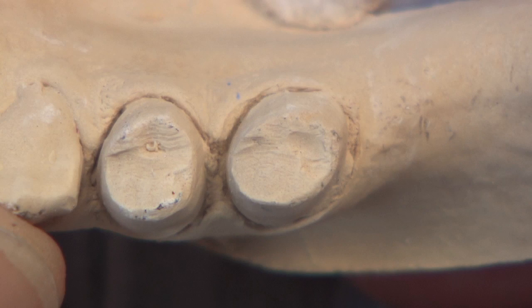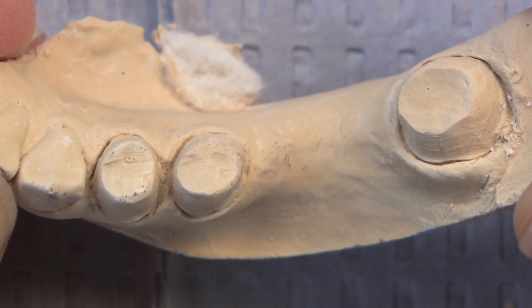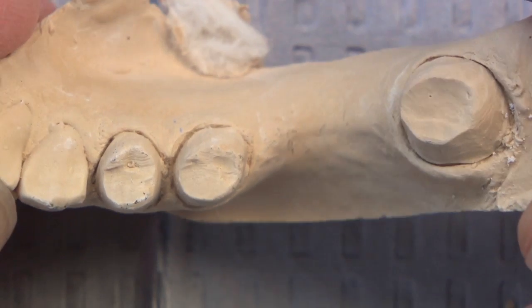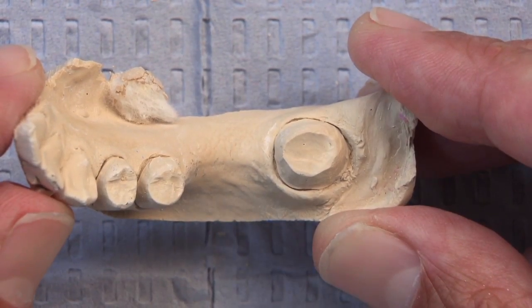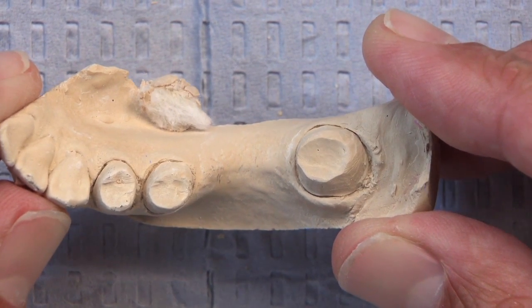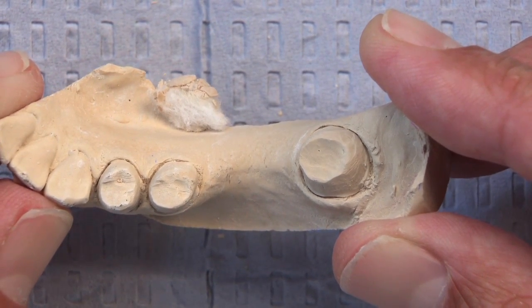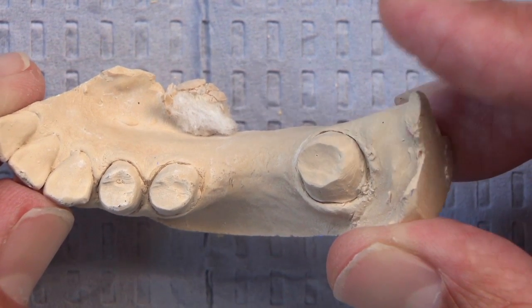As we zoom in here just a little bit, I can actually still see a little bit of occlusal anatomy, a little bit of the pits on the bicuspids. And we can see this wisdom tooth. These are always problematic trying to get those to draw. As I turn the wisdom tooth so that I can see down that line of draw, you can see now that we've got the distal of both bicuspids in an undercut. And then as I rotate this to try to see the distal of those bicuspids, now the mesial of tooth number 17, we've got an undercut there.